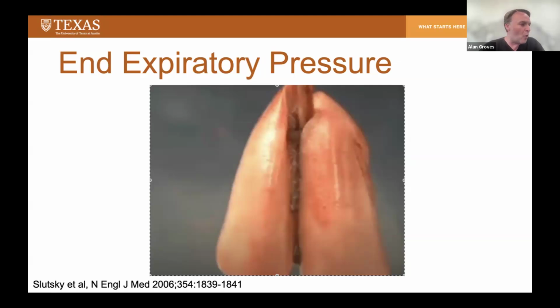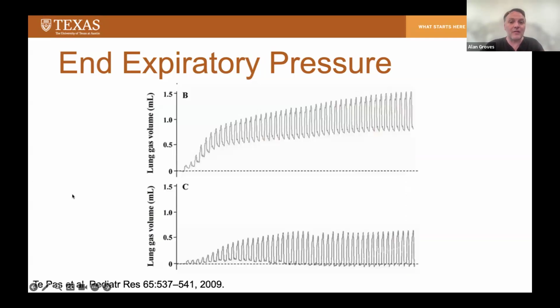We're talking about driving the overall lung recruitment. We're maximizing our functional residual capacity. And what we saw on the image a few seconds ago, whenever a few stubborn bits of lung were not fully open, is obviously much more marked in our babies with evolving BPD or severe RDS, where many areas of lung are atelectatic, and we really want to be making the best use of our lung recruitment maneuvers to maximize that lung inflation.